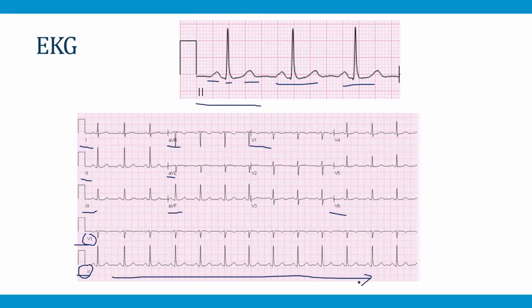And the idea here is to give the reading physician an idea of whether the beats are varying, with some coming early and some coming late. It's easier to see that if you have more beats to look at. But basically what we've got here are 12 different electrical leads, 12 different little eyeballs looking at the electrical activity of the heart and depicting it in this image of the EKG.